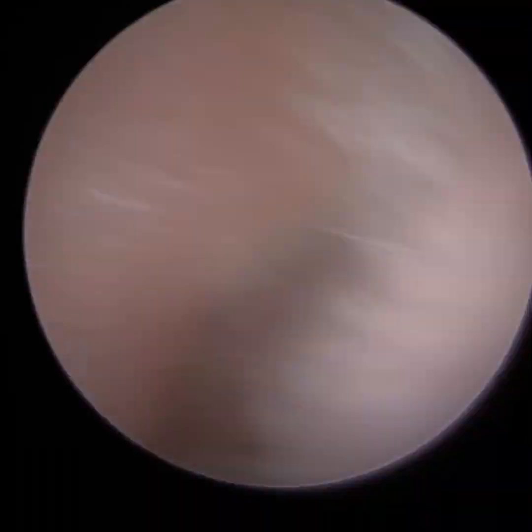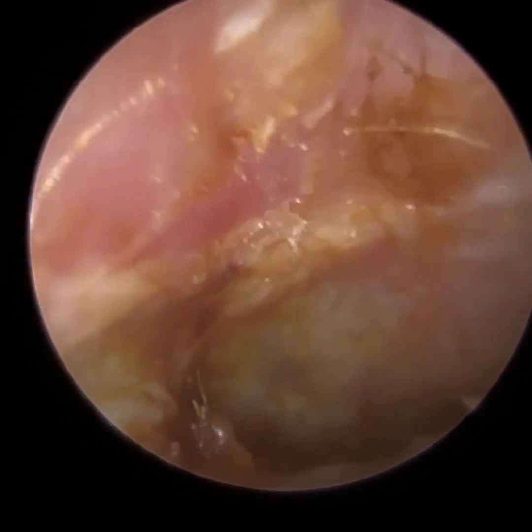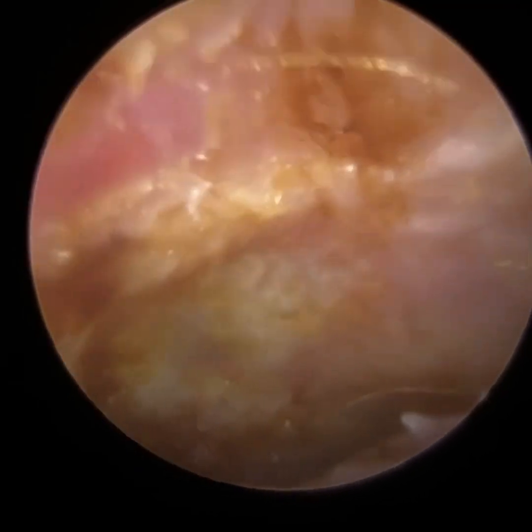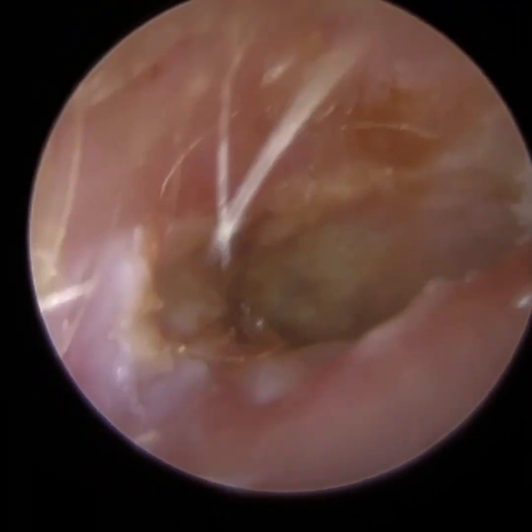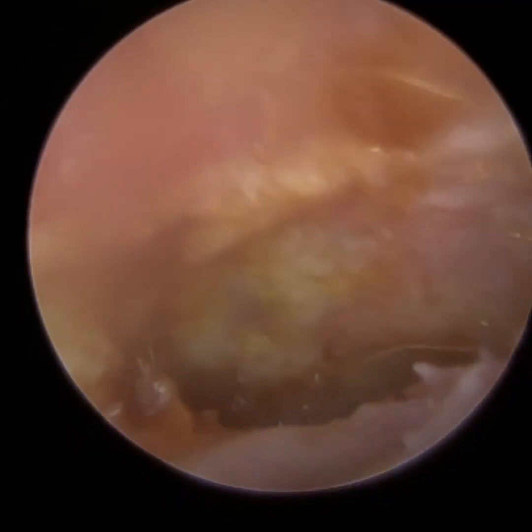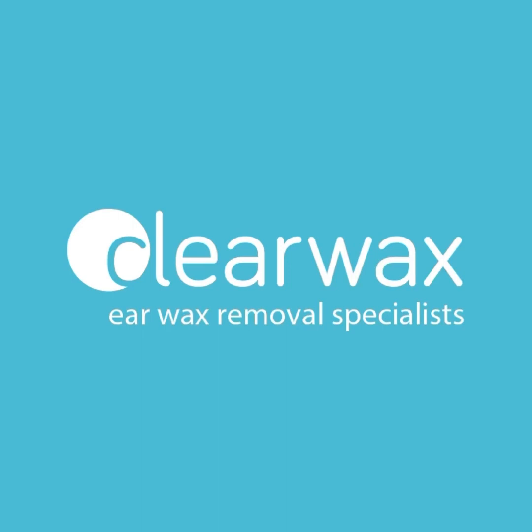Even with the endoscope, I'm really struggling to see fully anteriorly. But I think that gives a good idea of how narrow the patient's ear canal was. Well, I hope you enjoyed that video. If you are interested in the Waxscope, please do email info@clearwax.co.uk — we'll add you to our mailing list. Thank you.